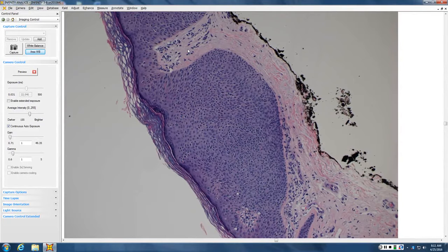So if it's a tumorous thing, it's not a tumor, it's not a cyst, it's an expansion of the epidermis, so we'd call that an acanthoma. Okay, so it's an oma, but it's an oma of acanthocytes, so it's an acanthoma. Does it look benign or malignant? Looks benign. Yeah, they look bland. And the cells are kind of spindled and whorled. So what kind of bland, spindled and whorled acanthomas do you get in skin? Anybody?